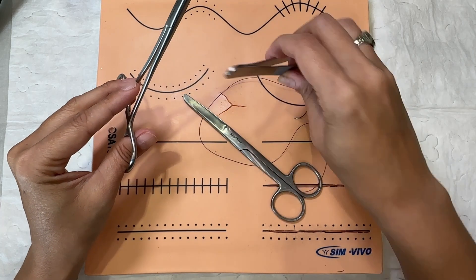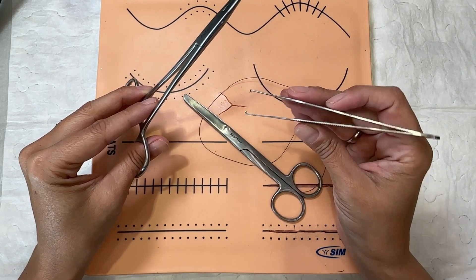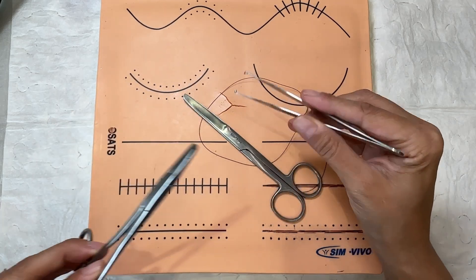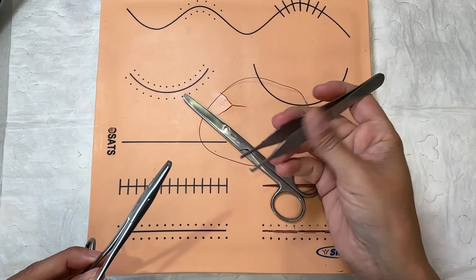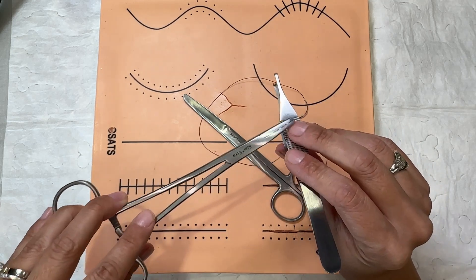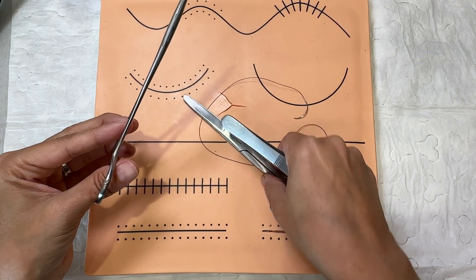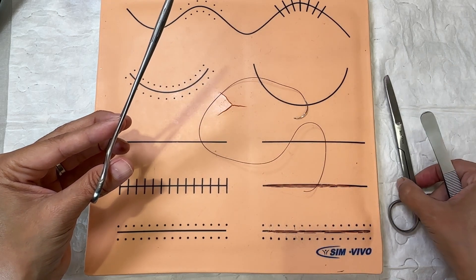Second, you're going to be using your right hand to hold your forceps. You want to hold them on top of the hand, not underneath like a messy eater — up here on top. Use your thumb and your index and middle finger to hold them.